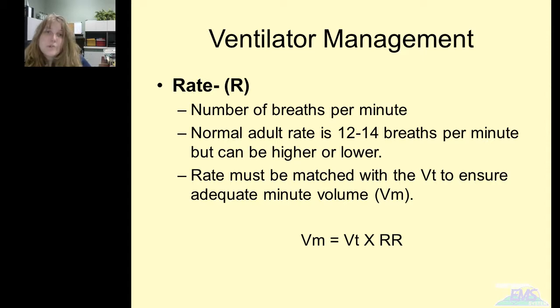Now what I'm going to do for you is I'm also going to provide in the course site under content for this particular module a formula to help you calculate the tidal volume and get that minute volume more accurately than even what this presentation provides. It's not necessary, it's not mandatory, but it's good for patient care, and it's much more accurate in determining the right amount for your patients on the vent. So I am going to provide you with that calculation, and if you have any issues or any questions about it, you can just come by and see me.